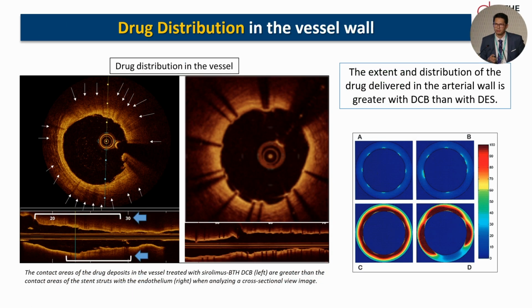This is important because we have talked about the distribution, the drug amount that we can deliver in the vessel wall. We are working a lot on this, and there were a couple of nice talks in the morning regarding the use of intravascular imaging or non-invasive imaging. So we are working on that from both sides, using AI to analyze the amount of drug that we deliver in the vessel wall, to track that drug once it's in the endothelium up to the medial wall.